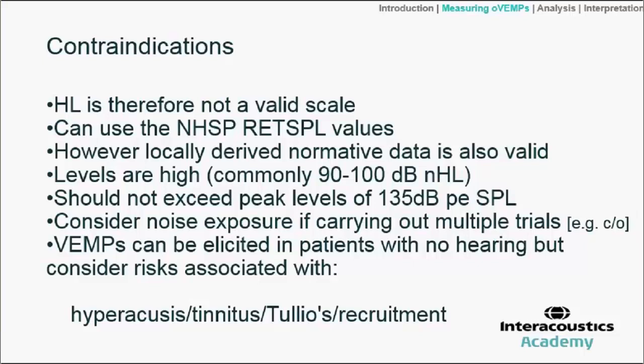And anyone who's particularly sensitive to sound, those with hyperacusis or perhaps troublesome tinnitus, Tullio, which is a vertigo sensation to sound, and of course loudness recruitment. Any patients like that, they might be either fully contraindicated or at least caution.